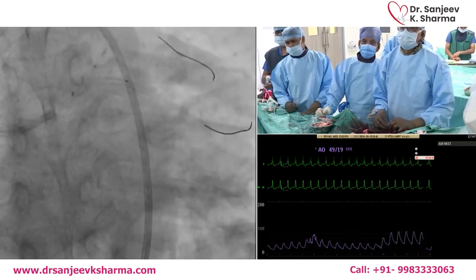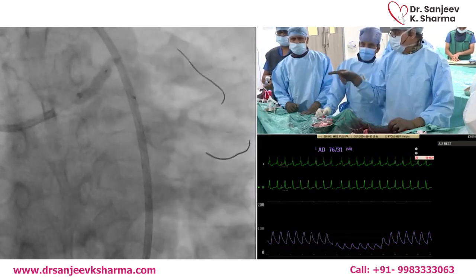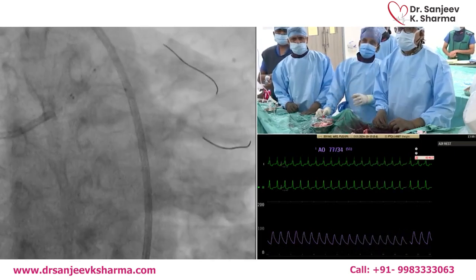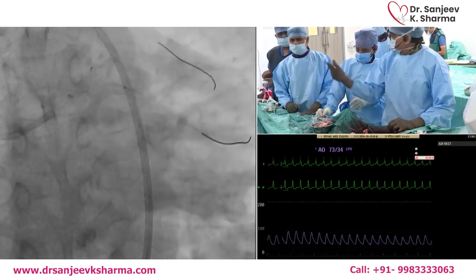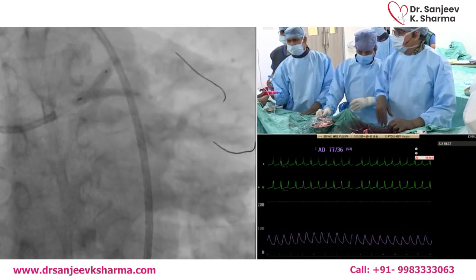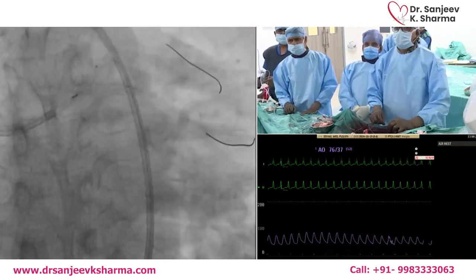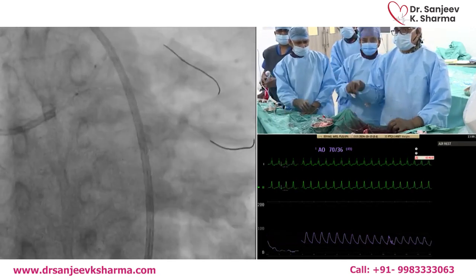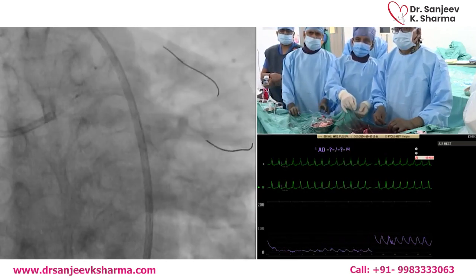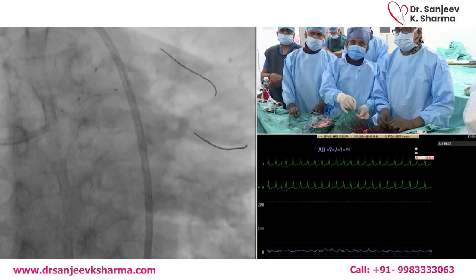Any question from the panel? Jitendra asked a very important question about the POT. Now a question from the audience. In one third of the cases, Dr. Samin is saying that we use hybrid IVL with orbital or rotational atherectomy. After every orbital or rotational atherectomy, do you do IVUS at every stage, or do you see with the fluoro only and then decide to go for the hybrid procedure? Second, is an NC balloon after orbital or rotational atherectomy, or a cutting balloon, required in every case, or do you decide on IVUS or on fluoroscopy markers only?